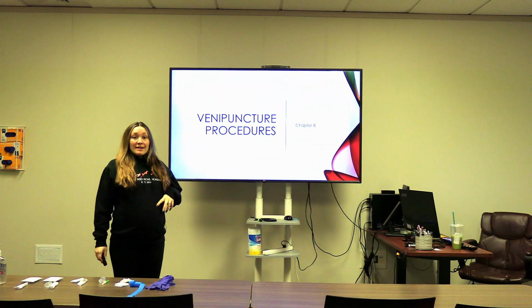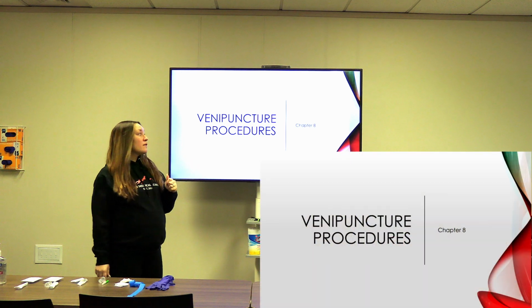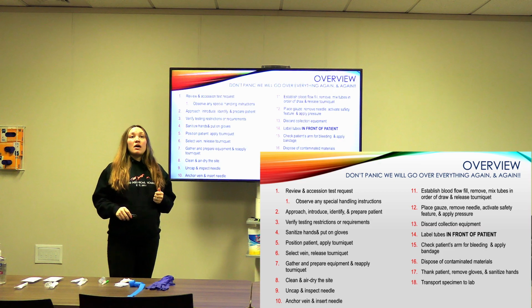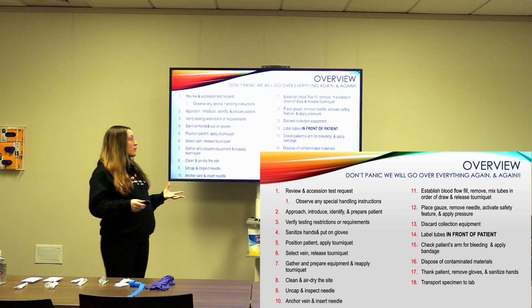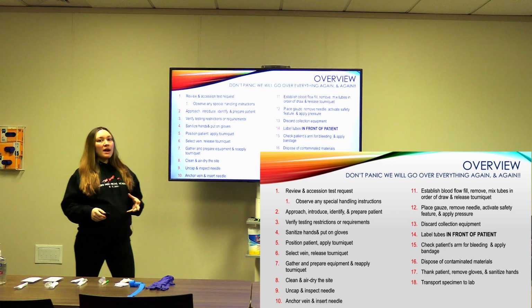Getting into chapter 8 now, our venipuncture procedures. We'll practice this a lot when you come for Skills Week. This is just a general overview of the process or the procedure of venipuncture. So we'll go through each of these steps individually, okay, and we'll talk more about what test requests look like.